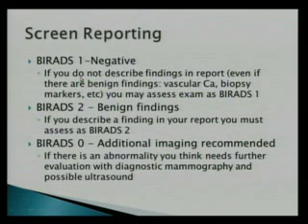Now, in breast imaging, there can be findings that you see but you don't describe, and that's perfectly fine. You give those a 1. If you don't want to talk about vascular calcifications in somebody who's 70, you don't have to. Just give it a 1, you're done. Move on. You can describe them, however, if you want to. And if you do, you have to give that a 2, because you're describing it and saying it's benign. So if you talk about vascular calcification or a radiopaque biopsy marker or axillary surgical clips or whatever there is, then you give it a 2 because you described something. But we don't have to. You don't have to describe those things.